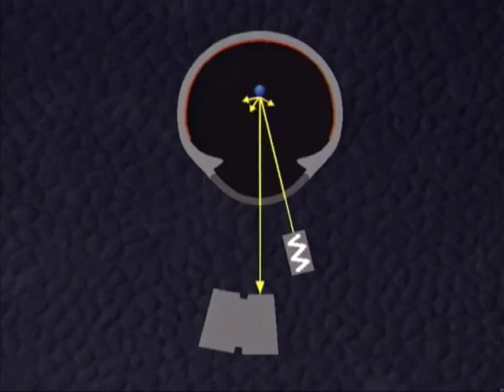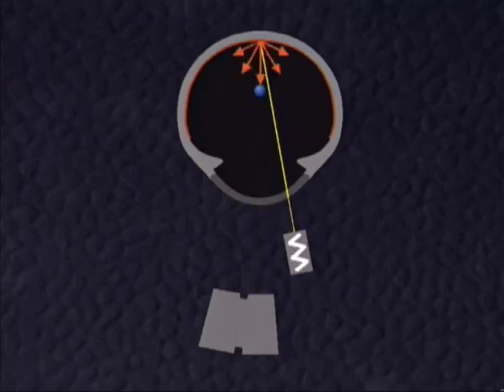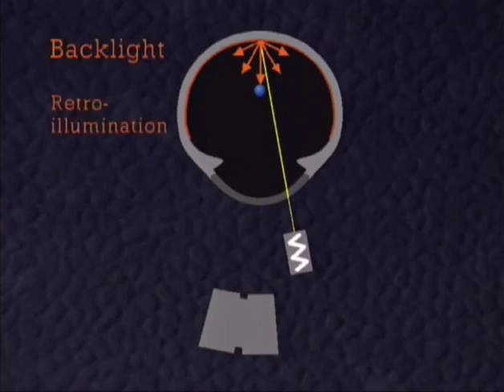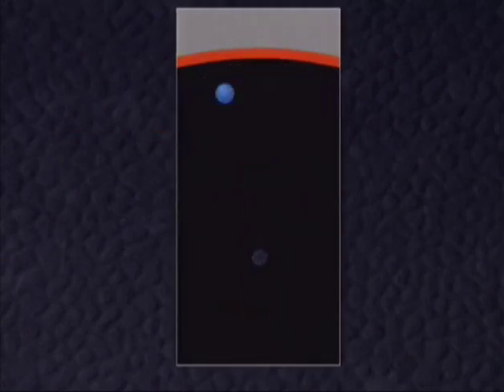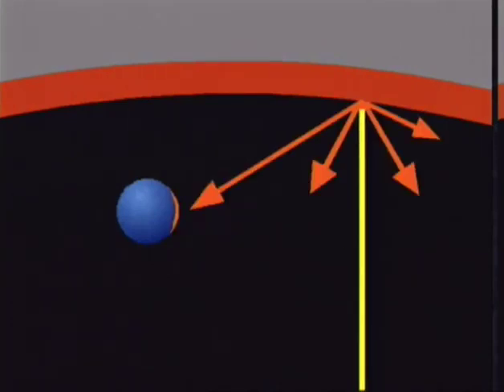For observing an object in indirect light from the fundus, the light beam is directed away from this object towards the background. There, the rays are reflected. They will provide backlight, also called retroillumination, for a target which is far away from the fundus. A target which is very close to the fundus may also be illuminated from the side, and this is called lateral indirect illumination.